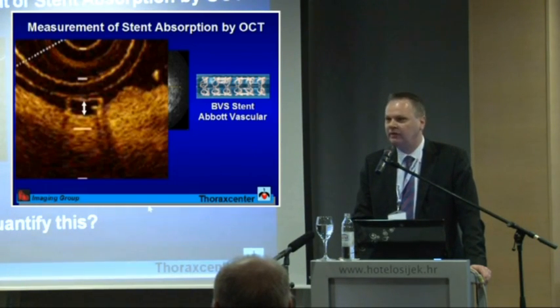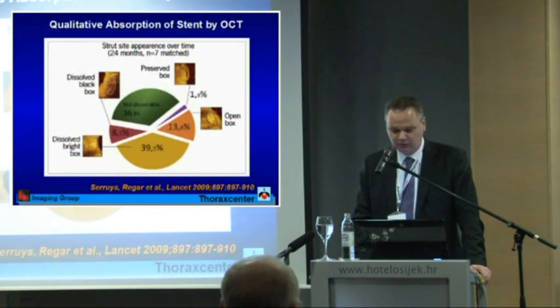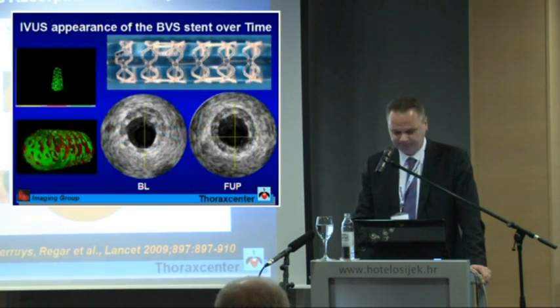And how to quantify that in numbers? We always like numbers to quantify it. Actually, we cannot do that with OCT. We can only perform a qualitative absorption, which has been proposed. You have dissolved black box, dissolved bright box, preserved box and open boxes.